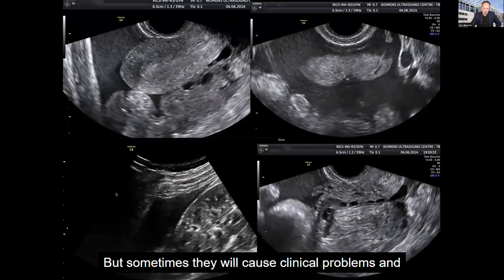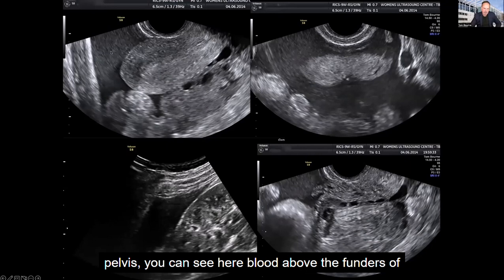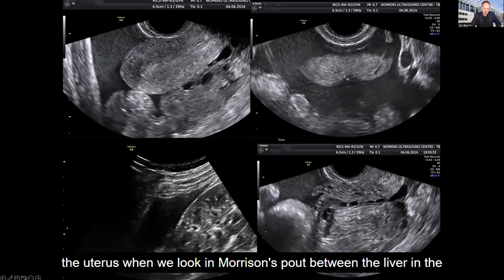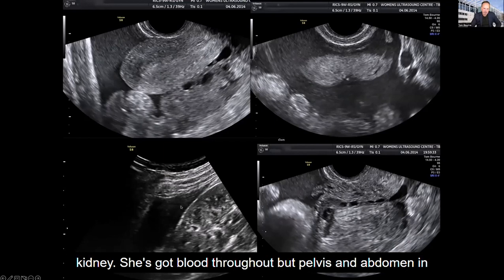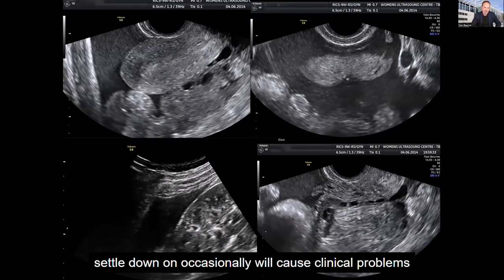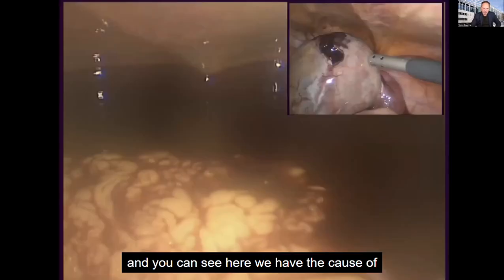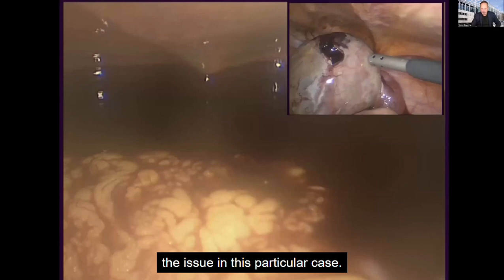But sometimes they will cause clinical problems. And you can see here how this lady has had, in fact, a collapsed hemorrhagic cyst, but a large amount of blood in her pelvis. You can see here blood above the fundus of the uterus. And when you look in Morrison's pouch between the liver and the kidney, she's got blood throughout the pelvis and abdomen. And this lady was taking anticoagulants. And so even though these are generally things that settle down, on occasion they will cause clinical problems. And you can see here we have the cause of the issue in this particular case.